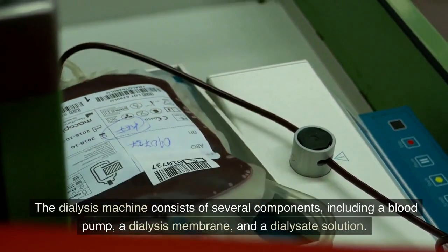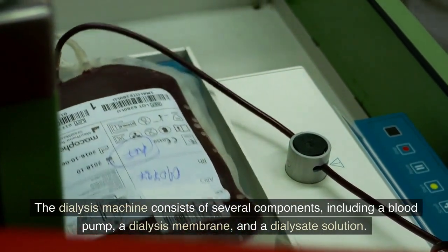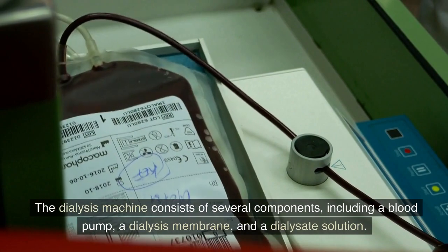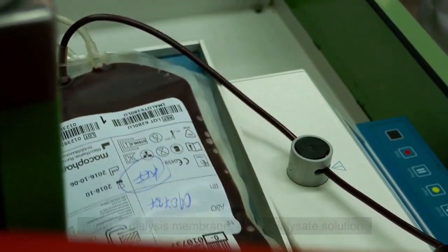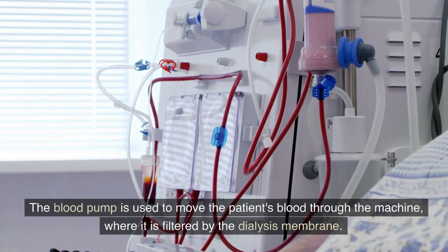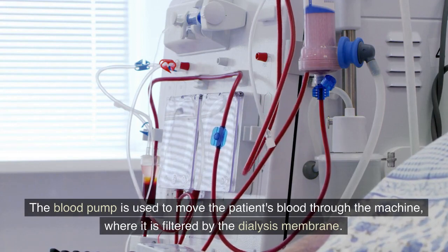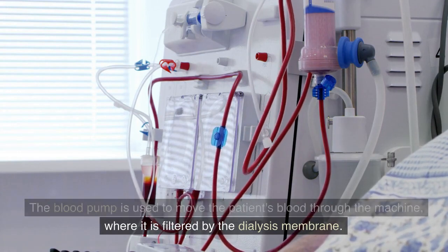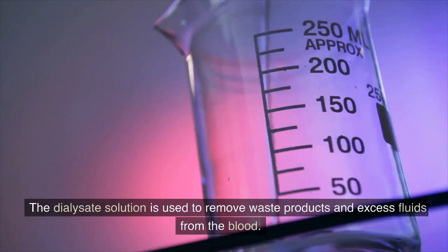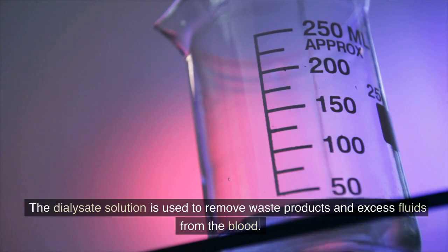The dialysis machine consists of several components, including a blood pump, a dialysis membrane, and a dialysate solution. The blood pump is used to move the patient's blood through the machine, where it is filtered by the dialysis membrane. The dialysate solution is used to remove waste products and excess fluids from the blood.